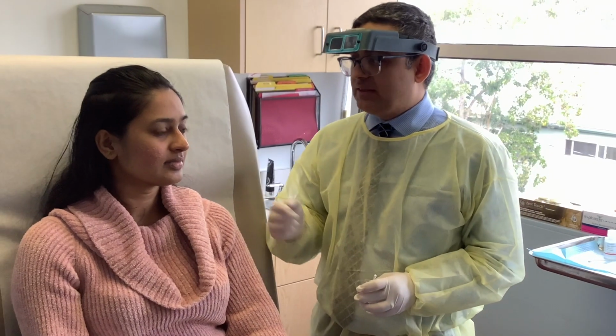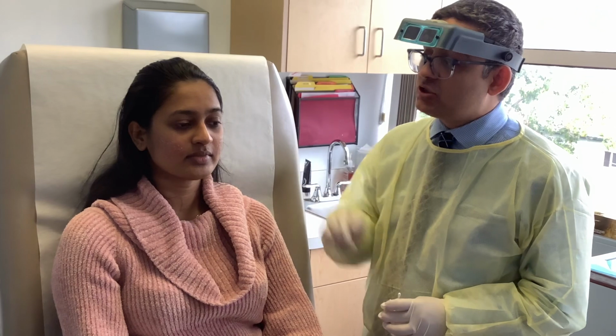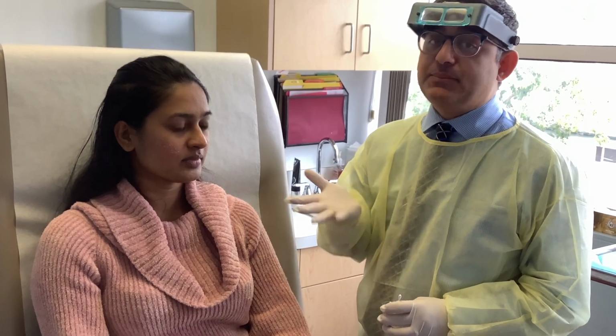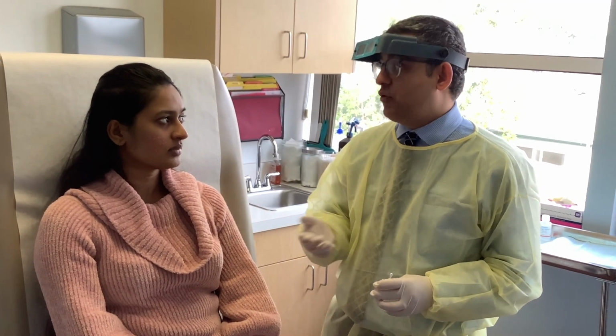We just finished our second round of TCA cross technique on these acne scars. She got a very good result with the first session, better than average. Typically I say about 10 to 15%, but she did really well. This is the reason why I always do TCA for the first couple of sessions before I do subcision or CO2, because you want some of those deep scars to fill in before you start resurfacing them.